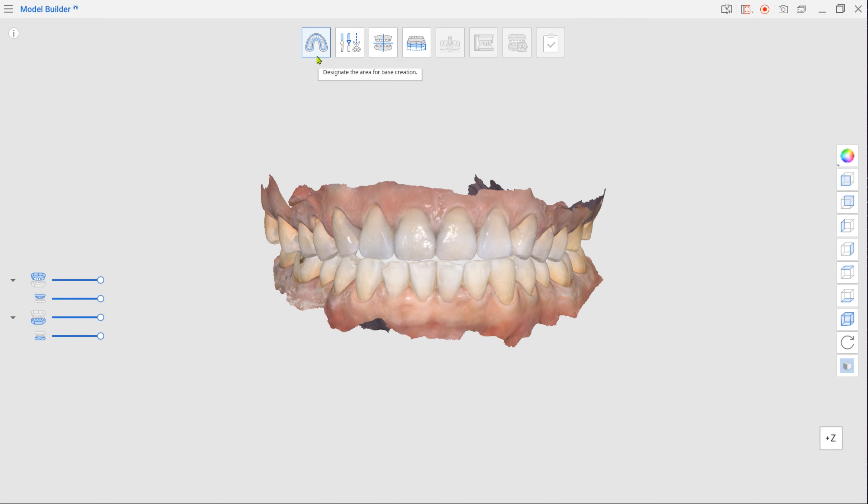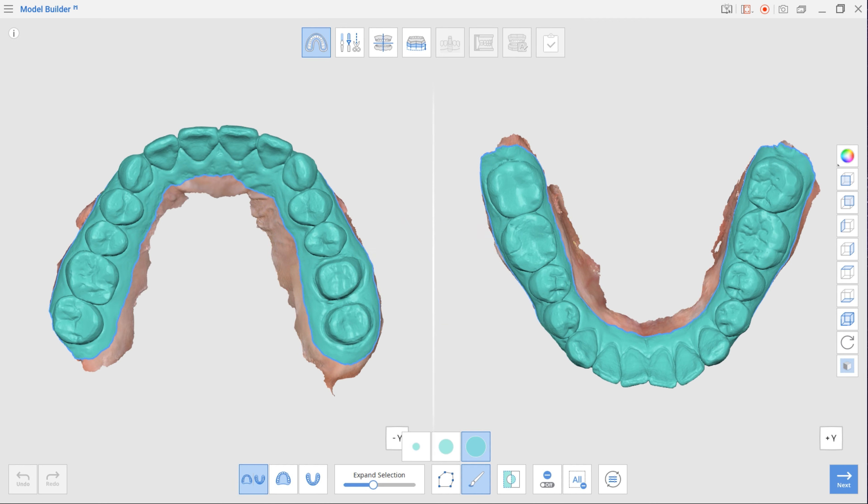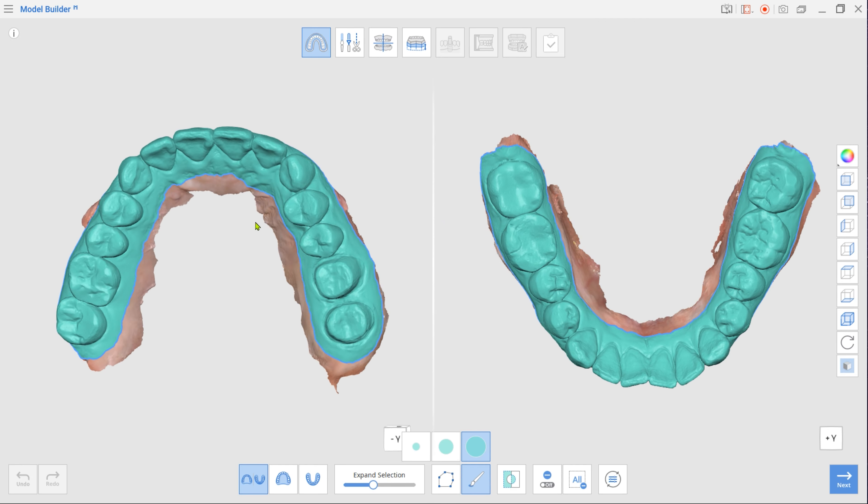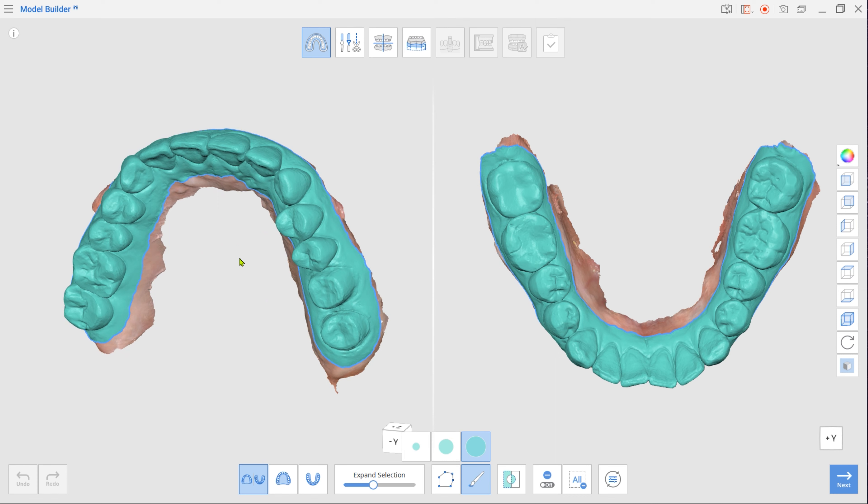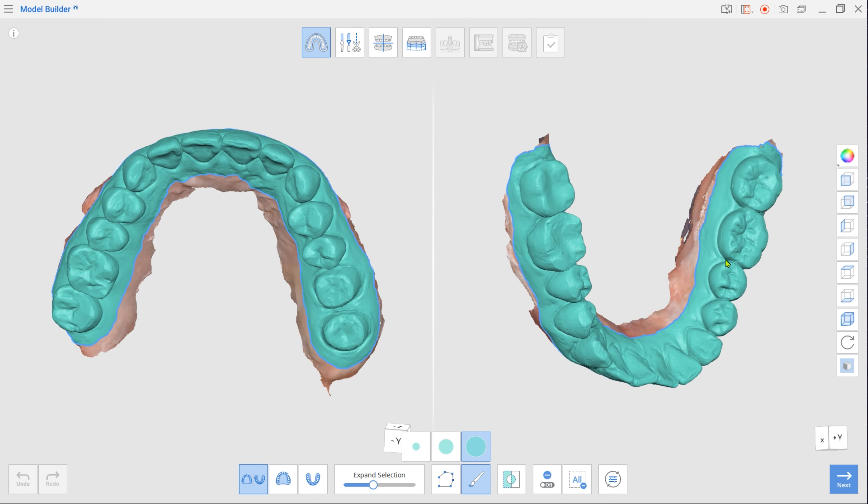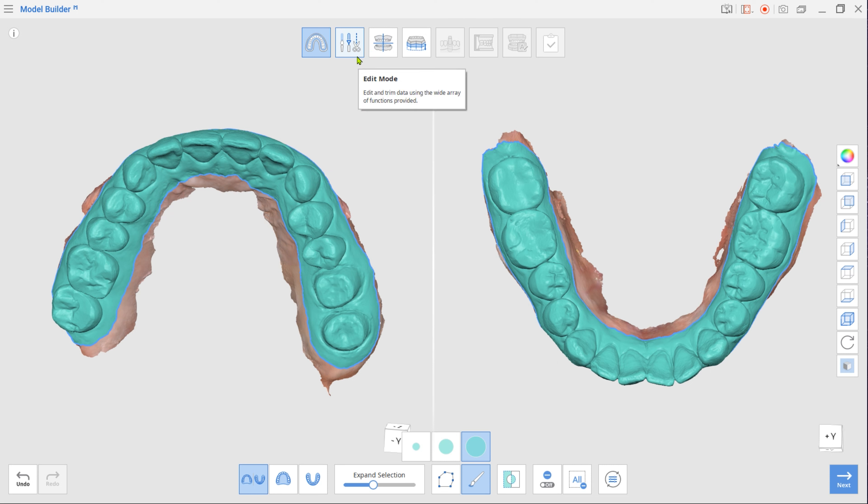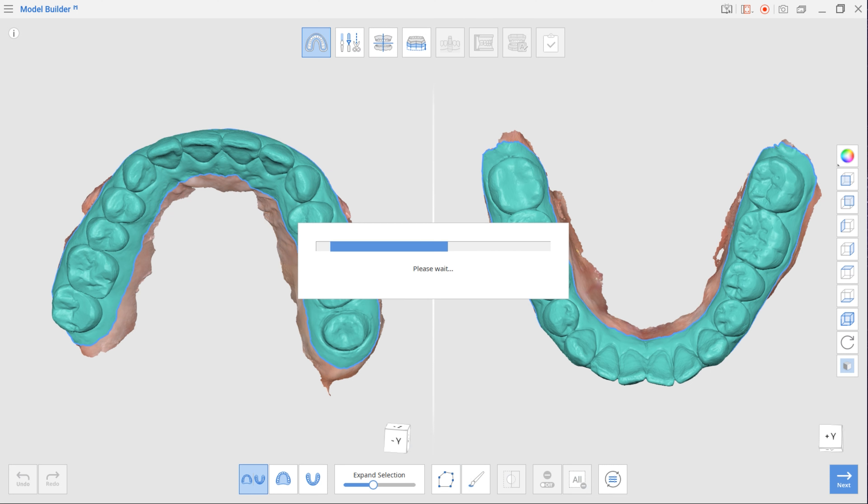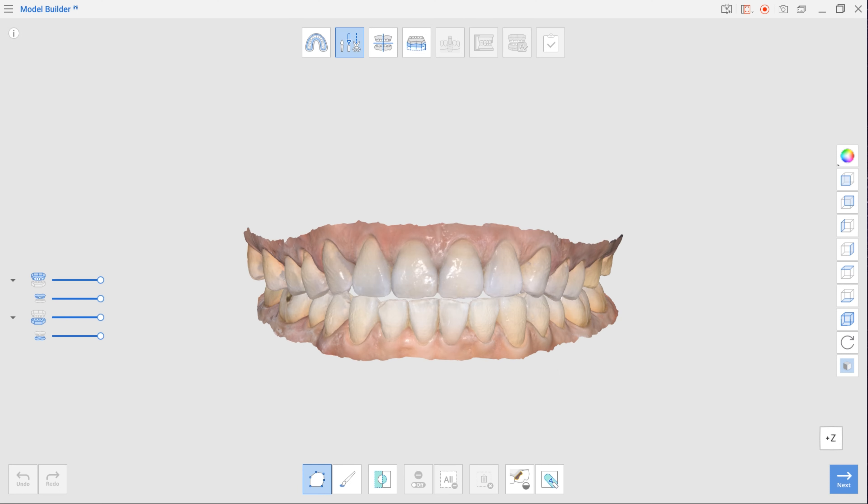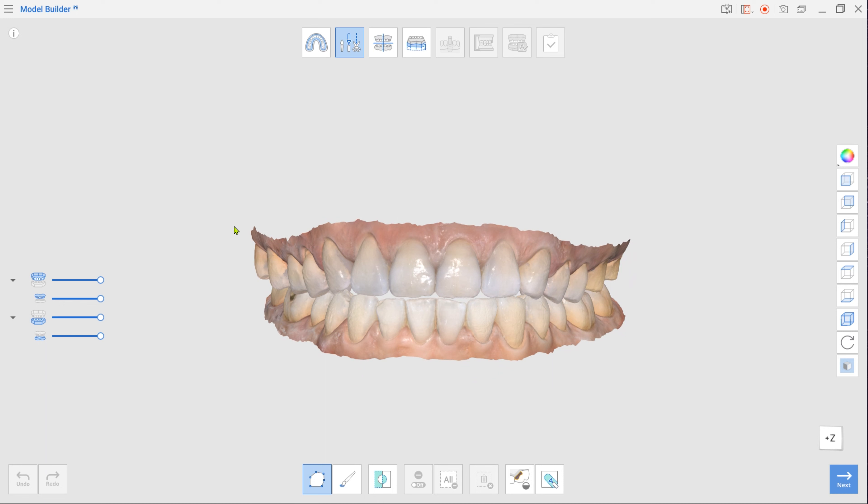First is Area Designation mode. Enlarge selected areas using the Expand Selection slider. Left out parts can be selected with brush selection. Click Next to move to the Edit mode, where you can trim the scan data or fill in holes.